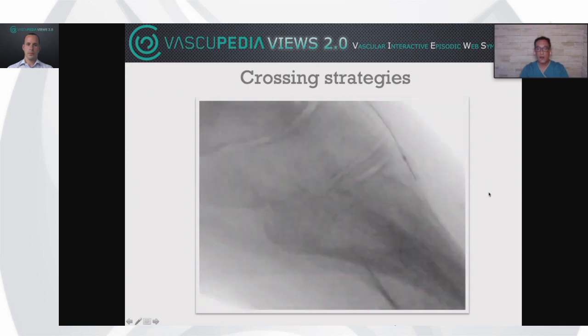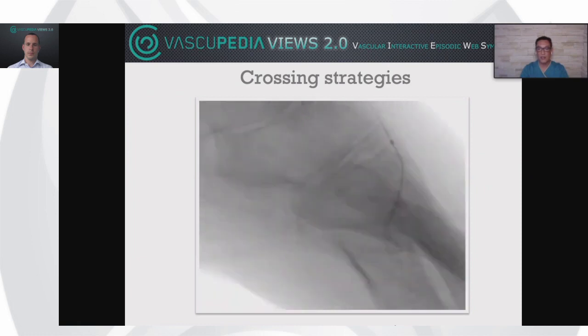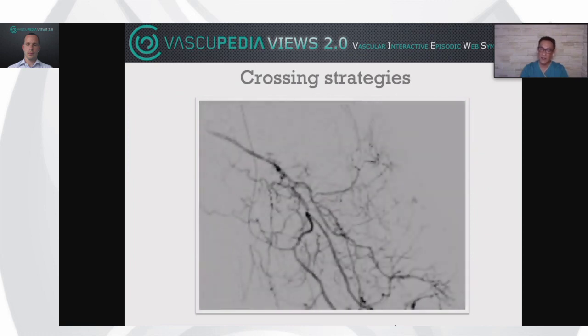So let me show you an example of a type 2A recanalization of the arch. So we put our wire, get into the first metatarsal, get back. So engage the ostium, slide the wire up to the occlusion. We switch the projections to see what's going on with the wire, cannot get through. And then we will need the support catheter and, surprise, the arch was not actually occluded.